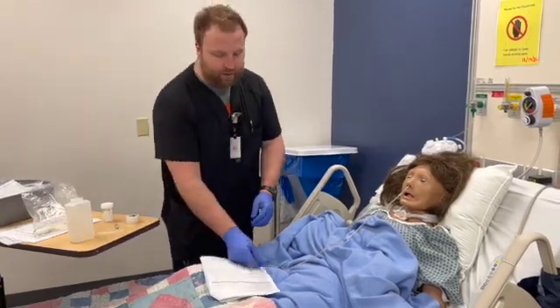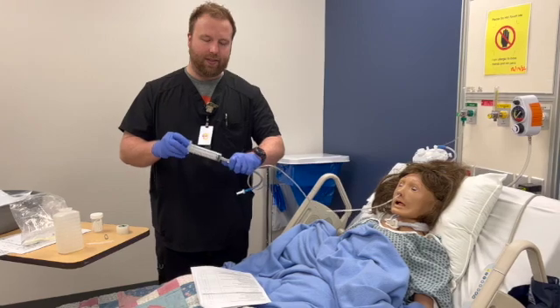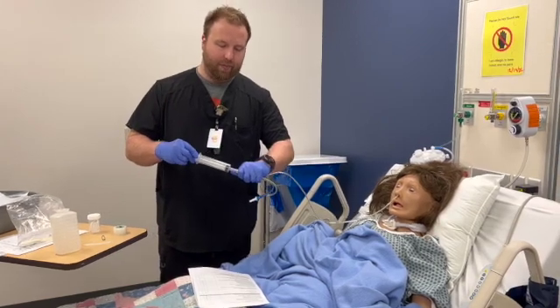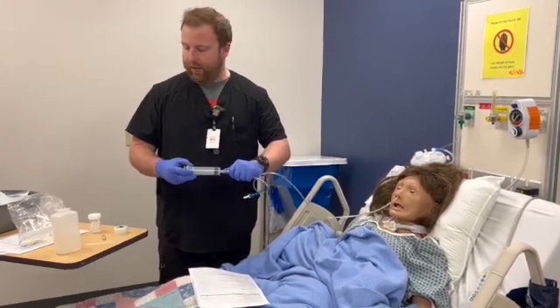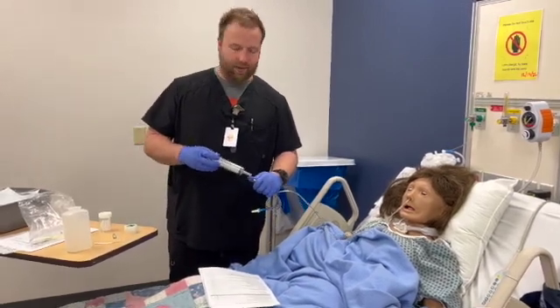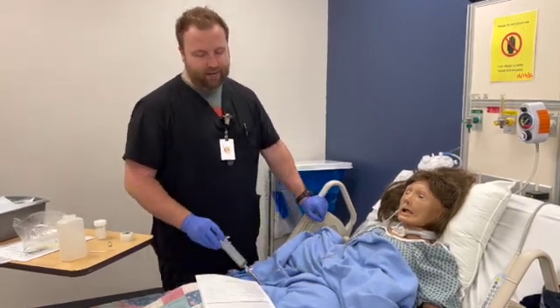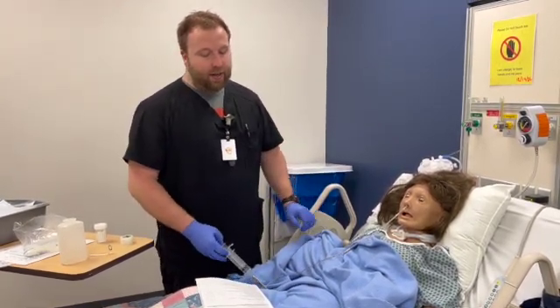We will aspirate our stomach contents. We'll put this in here in the tube, just pulling back up a little bit, enough to get just a little bit in the tube. We will pour this onto the pH strip, looking for a low result, expecting it to be a high level of acid content.